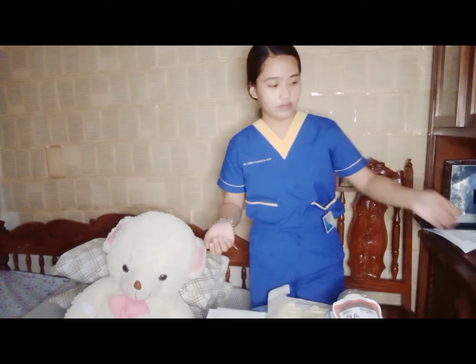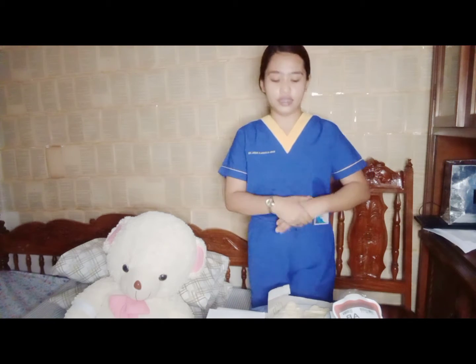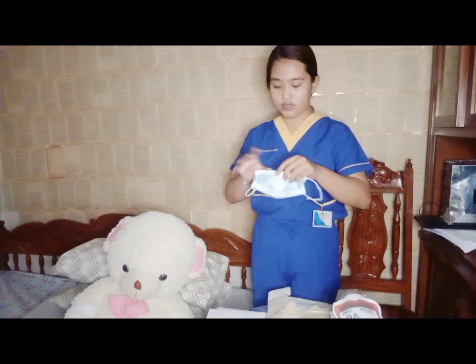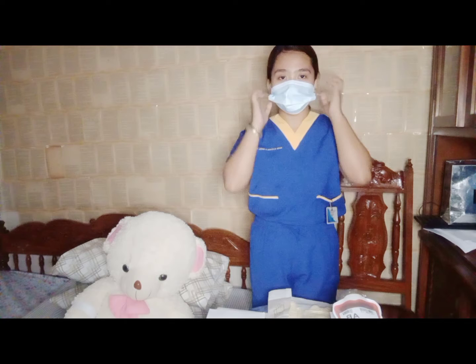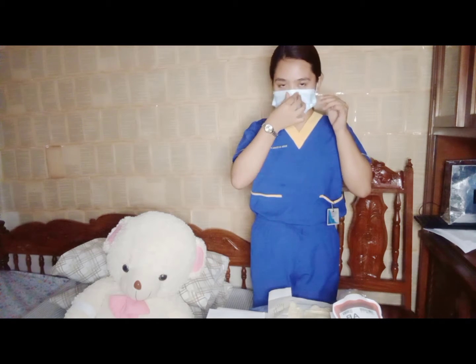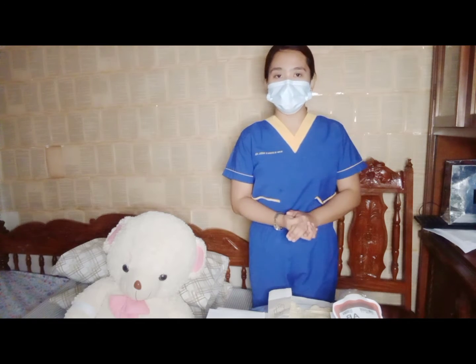Okay. So, after gathering the equipment, we need to perform hand hygiene and wear the PPE. This is to prevent contamination, and PPE is required for transmission precautions. Assume that I have already done hand hygiene. I'm going to wear the face mask. Then after this, we will check the patient.